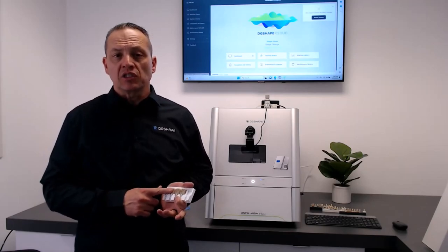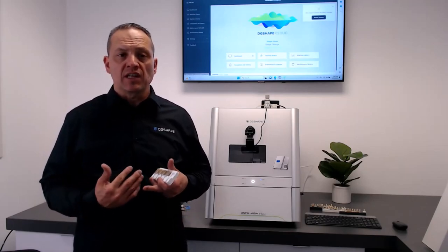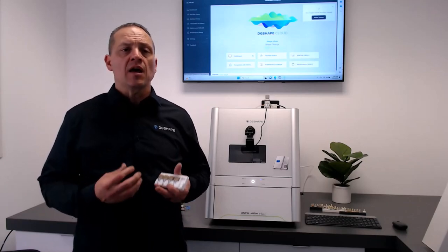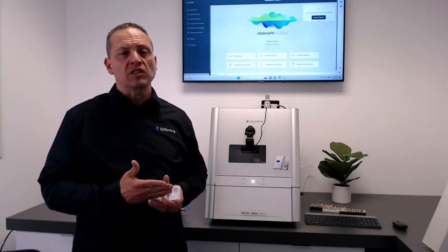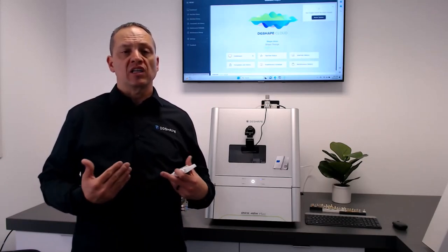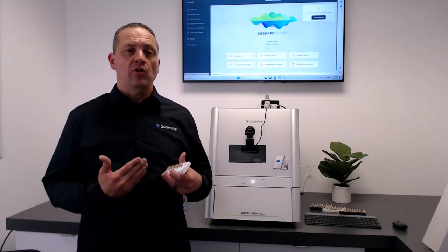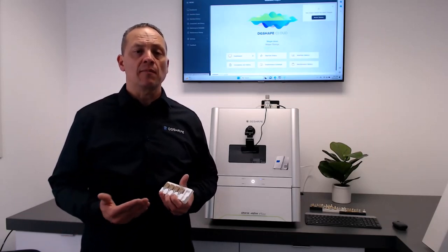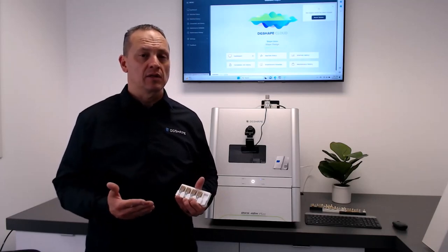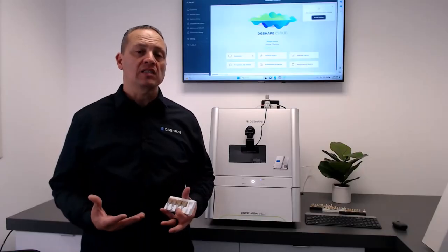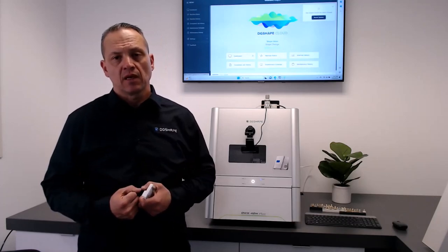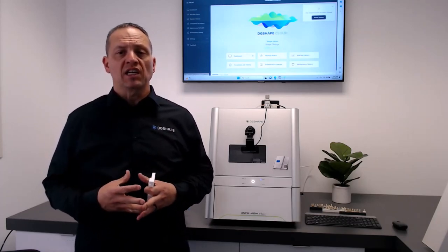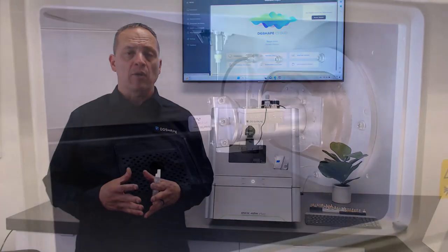Graded translucency. Amber Mill Direct achieves natural translucency by applying a graded microstructure from the cervical to inciso-occlusal regions, without additional characterization. Increased efficiency. Minimal finishing time makes same-day restoration a possibility. Save time without compromising strength and aesthetics. Visit us at www.RolandDGA.com/AmberMill.